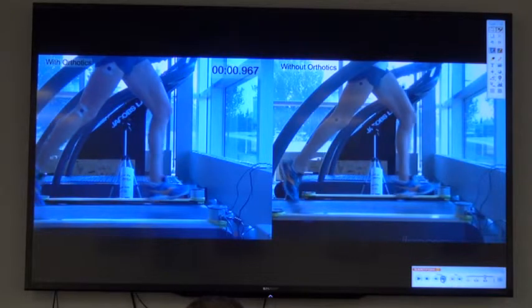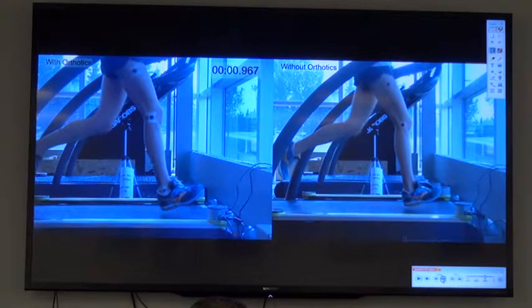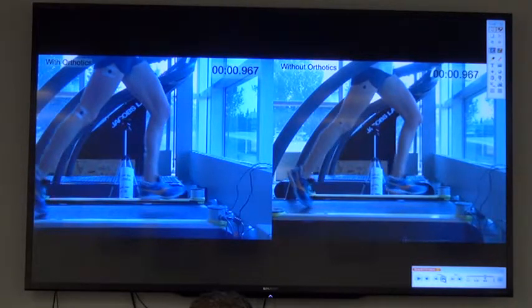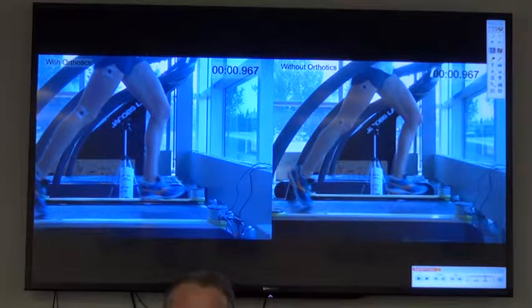And then on this side, similarly, just in case I don't have them synced properly, I'll do another step analysis here. So that's her first contact point. I would put a clock on here, and I would set it to 0 at that point. And then moving forward, right there, I would stop counting. So her stride length, her contact phase on her right foot is that. Okay, and then I would do that same thing on the left foot.